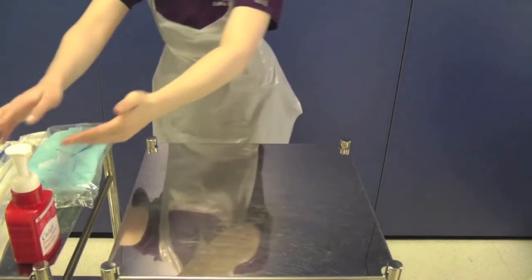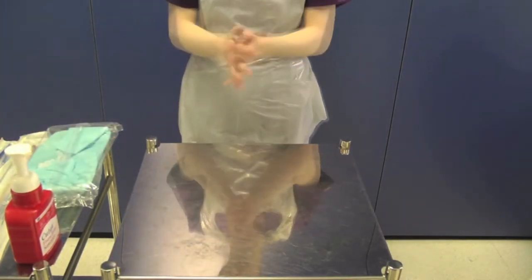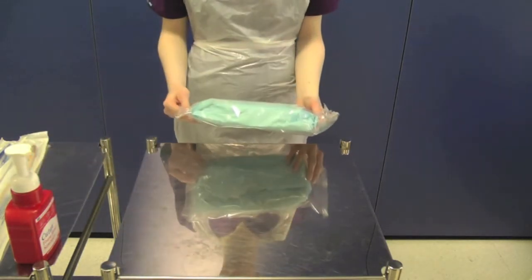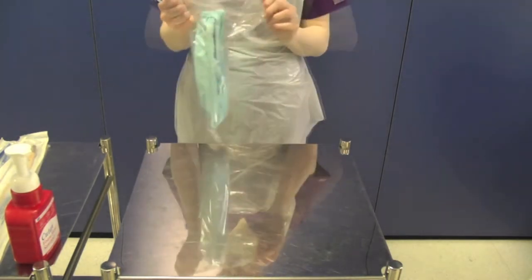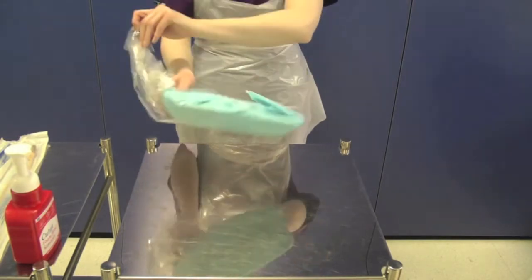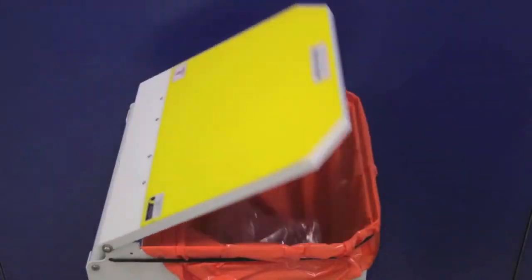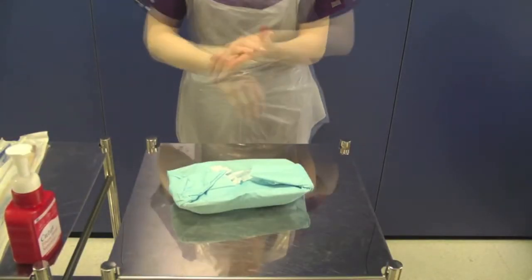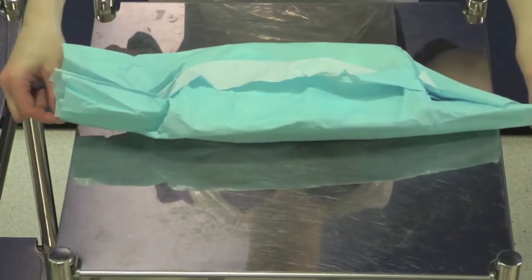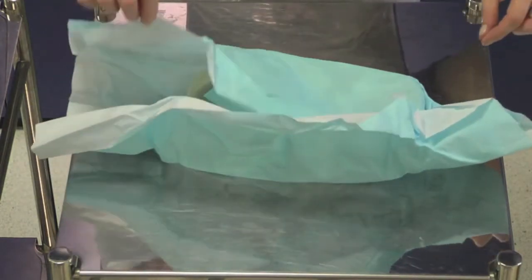Once you have cleaned your trolley, don an apron and decontaminate your hands using the WHO 7-stage hand washing technique. This must be used every time you decontaminate your hands. Take your catheter pack and check that it is in date. Open the pack onto the trolley without touching the contents. You must decontaminate your hands as you have been touching outer packaging. Carefully open up the sterile catheter pack. You should open the pack away from you first of all.